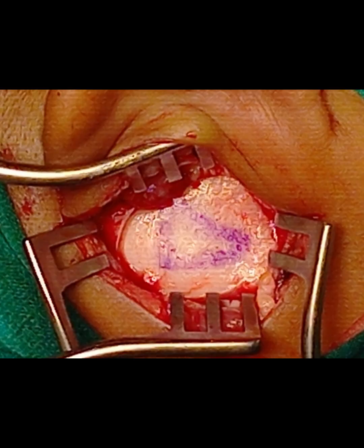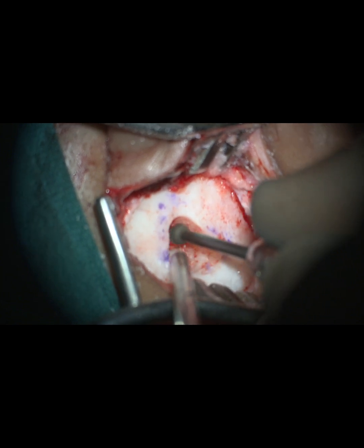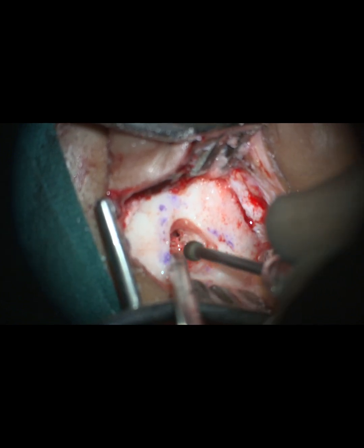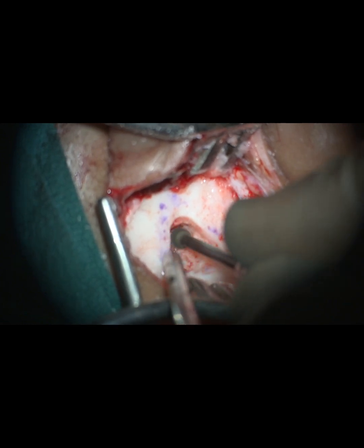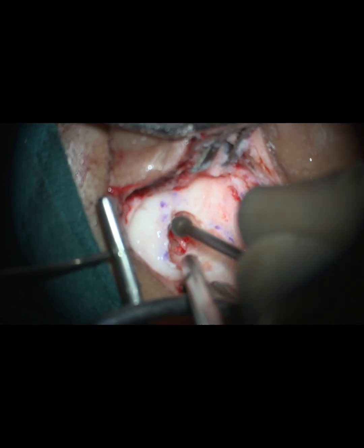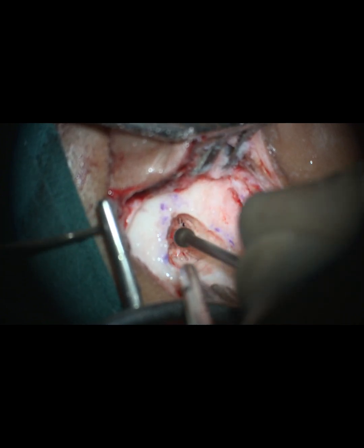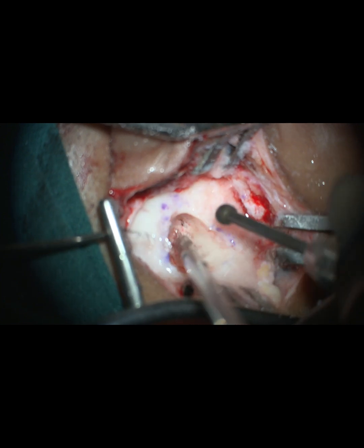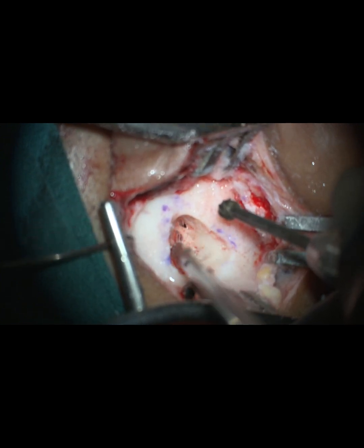You have seen a CT scan where the right external auditory canal was completely bone opacified, and we planned for a posterior approach, that is a transmastoid approach, for this patient. And there are two approaches. We can go for an anterior approach also, that is transcanal, but that has more chances of complications, injury to the vital structures like facial nerve, TM joint, ossicle chain, etc.